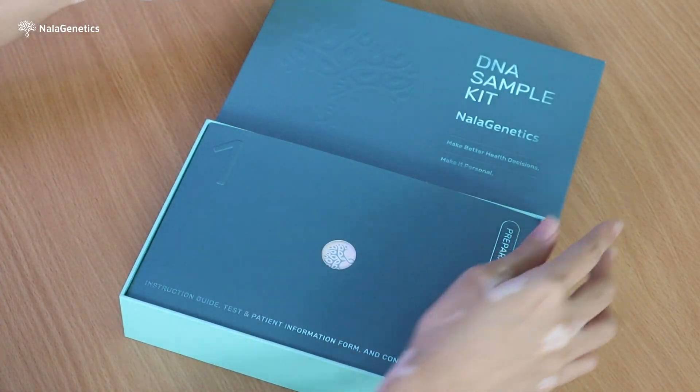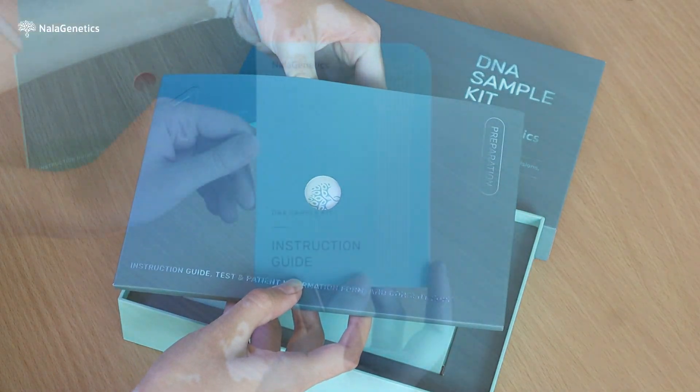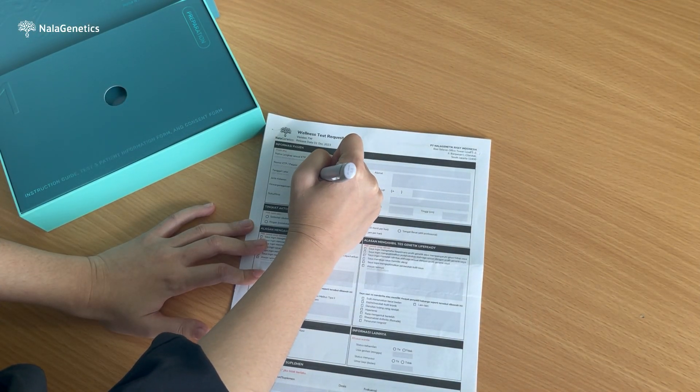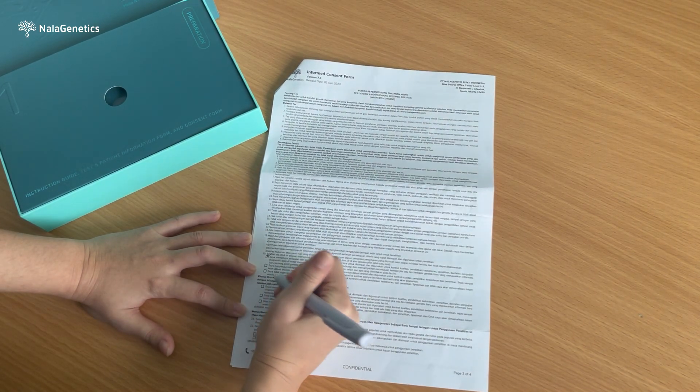First, open the kit and make sure that you have received the following items: instruction guide, test and patient information form, and consent form. Our team will guide you to fill in the test request form. Make sure to fill in all the necessary information.